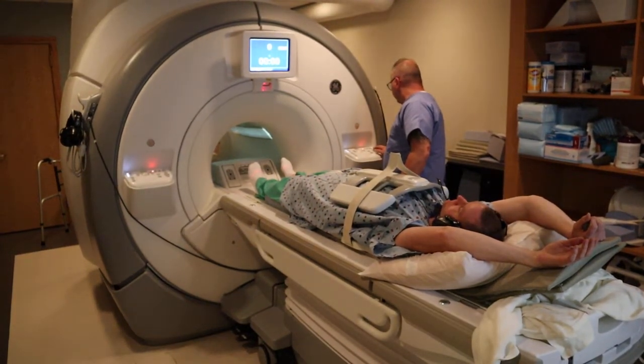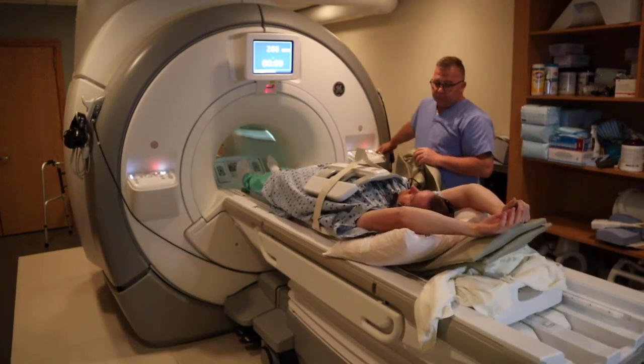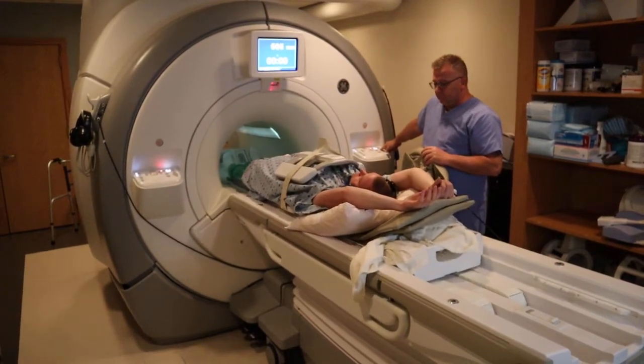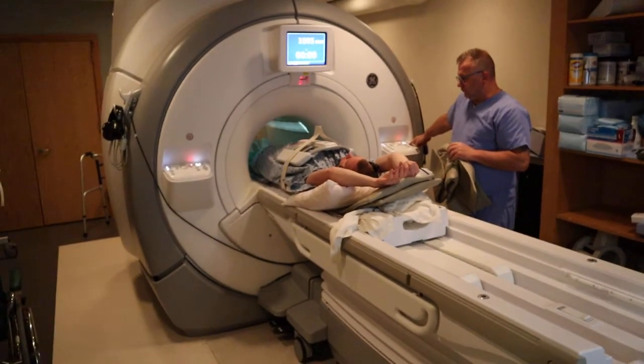You want to make sure that the patient's elbows are not touching the bore of the magnet. Always provide padding to ensure that the elbows and the arms are not touching the bore of the magnet.